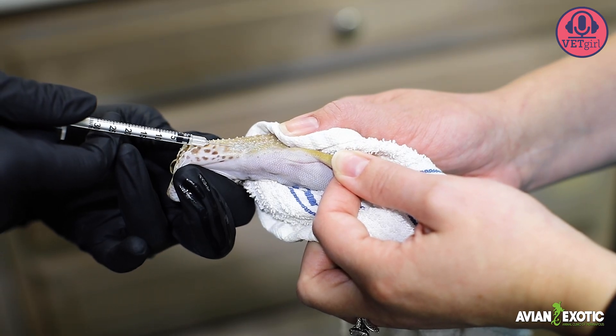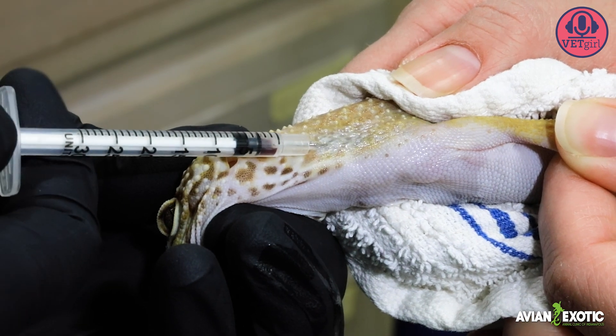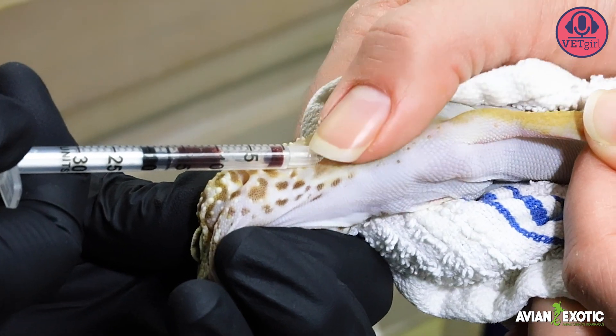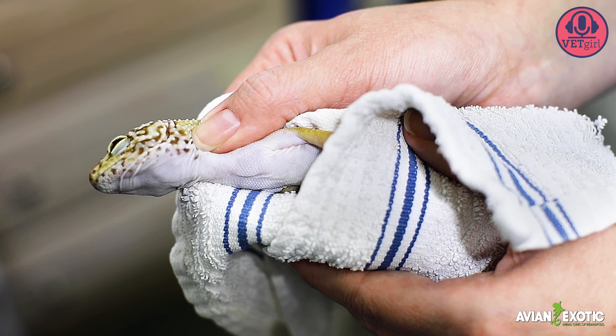Insert the needle at a 35-45 degree angle. Aspirate gently to get the sample — excessive aspiration will collapse the vein. Collect the sample, withdraw the needle, and then apply direct pressure to the site for 10-15 seconds or so.